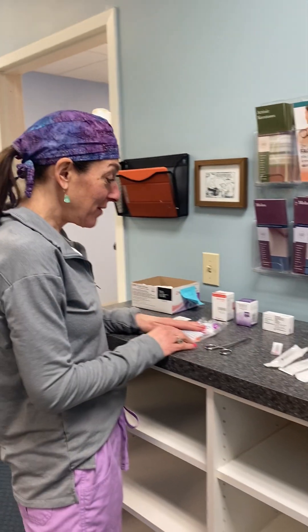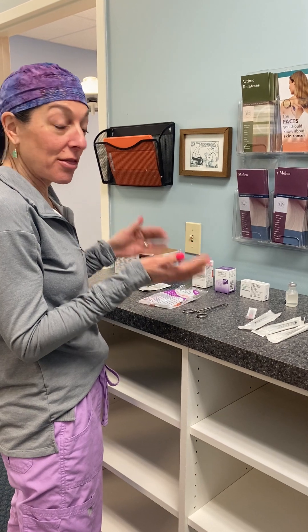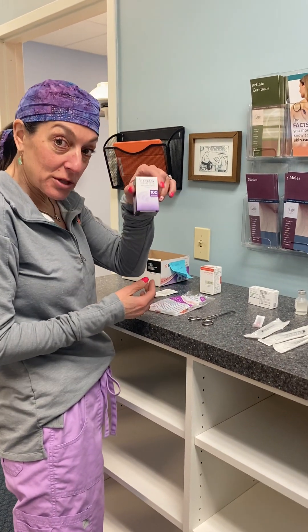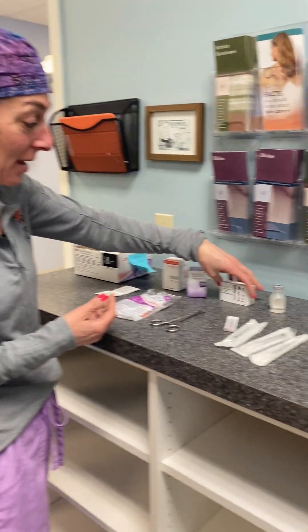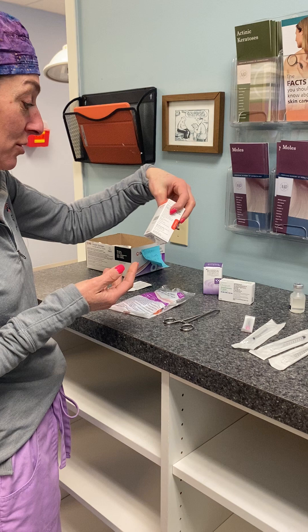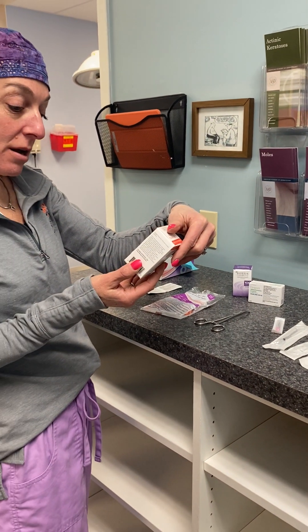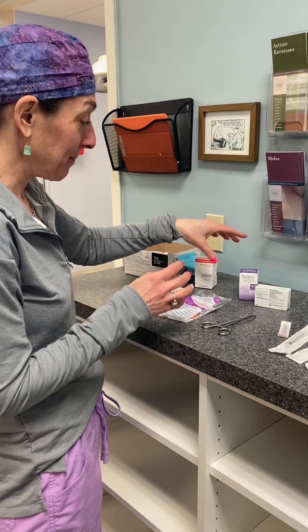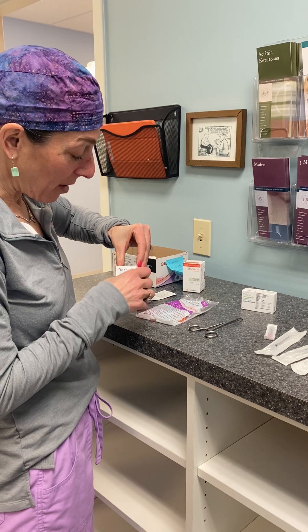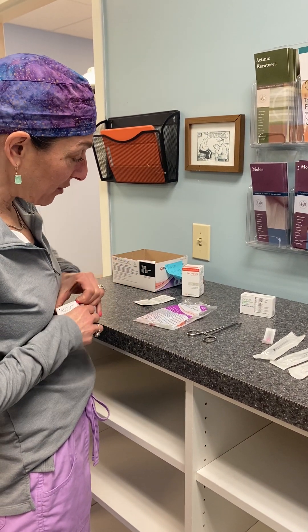This video covers how to reconstitute the three main neurotoxins: Botox made by Allergan, Dysport made by Galderma, and Jeuveau made by Evolus. Botox and Dysport are reconstituted the exact same way.